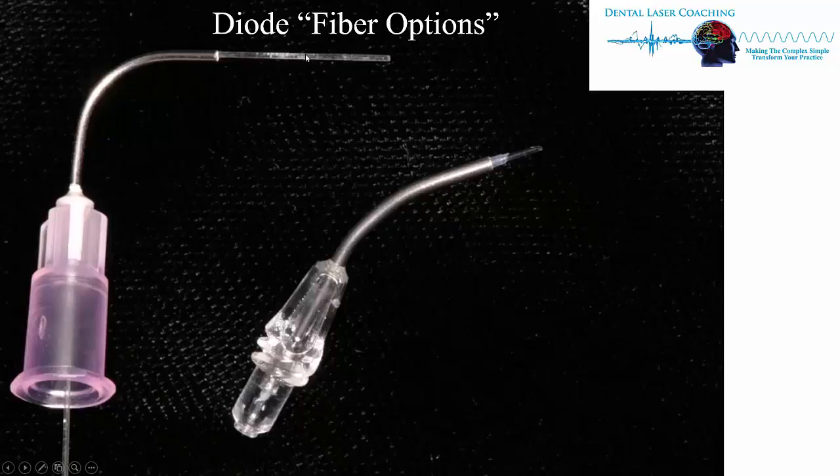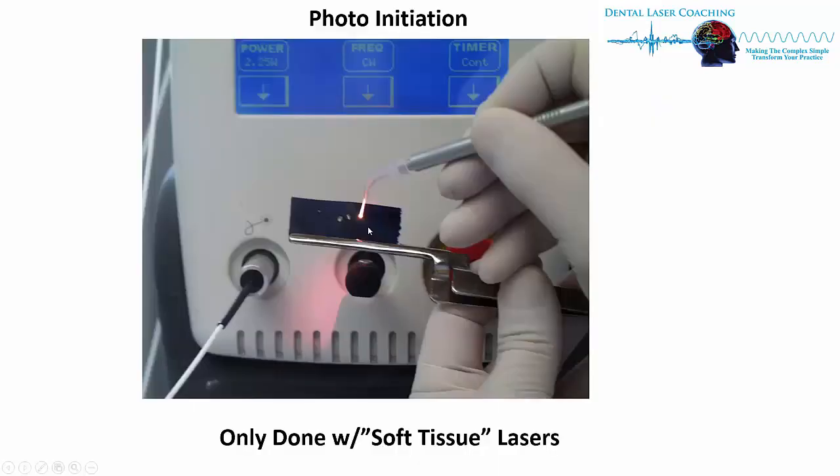We're talking about diodes now, and you cut a little bit off after every procedure, or you can screw on a tip that you just throw away. It's disposable. With diodes on this fiber, we do what's called photoinitiation, and this is only done with soft tissue lasers. This is not done with the erbiums or the bone cutting or the CO2 lasers. It's just done with our soft tissue lasers.